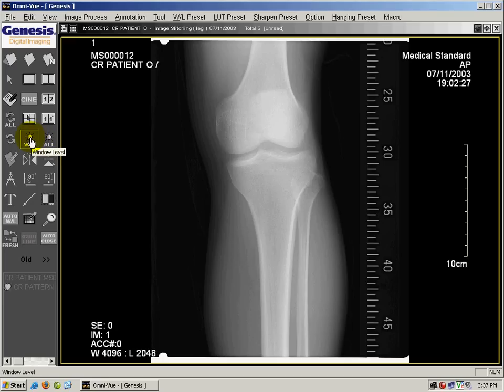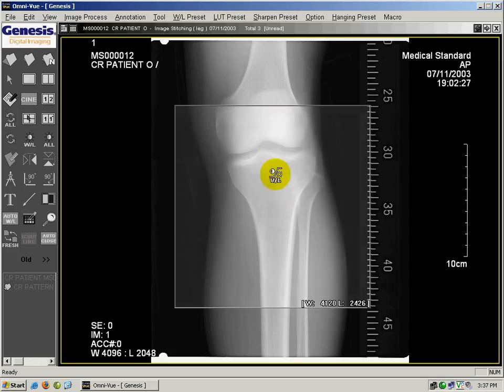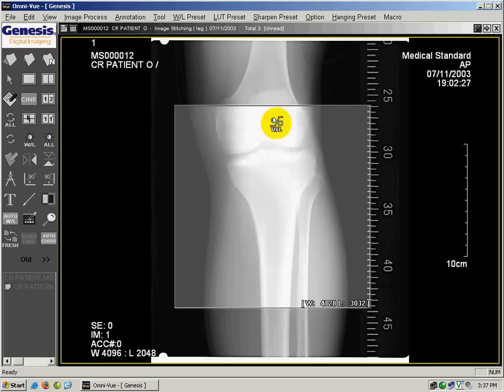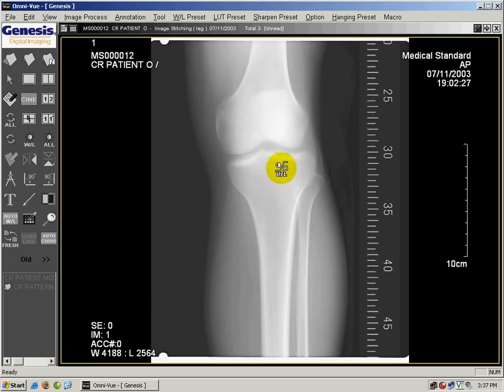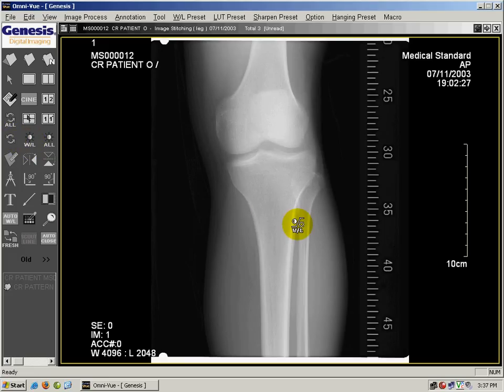To window level an image, you can left click and select the window level button. You can click and drag the mouse to adjust the brightness or contrast — left and right for contrast, up and down for brightness. If you want to undo any changes that you've made to an image, you can click on display original and that will revert the image back to normal.